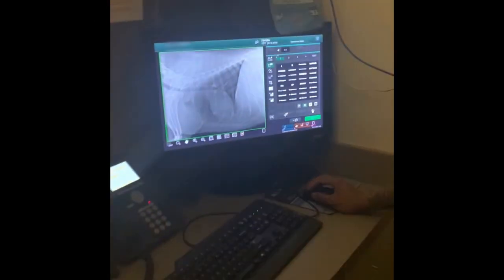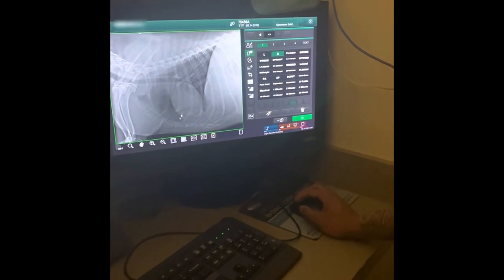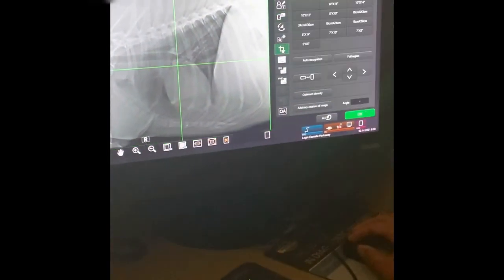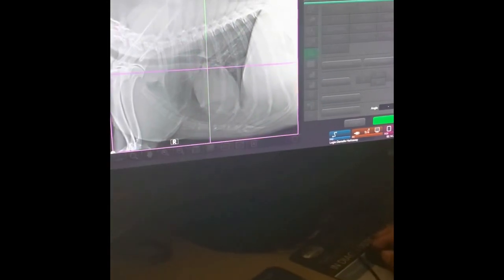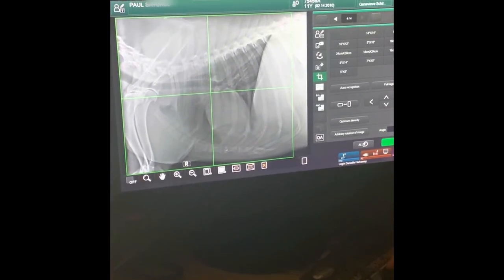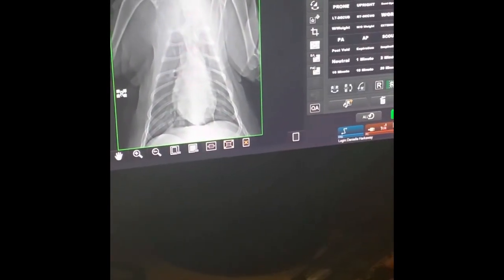After I've finished taking all my x-rays, I'm going to crop all the extra parts that I don't need, and also place all my markers in since this dog was too big and they weren't able to fit in the image. When my x-rays are all set and they look good, I send them off to the radiologist to get approved.